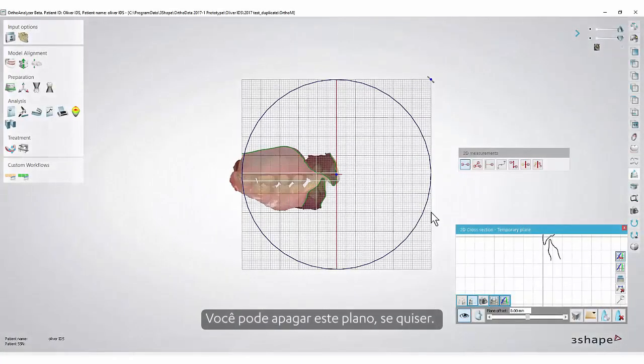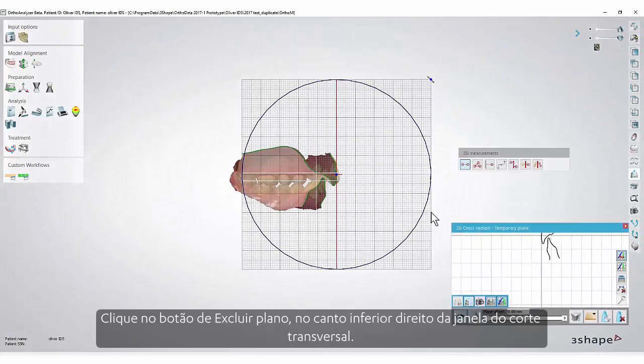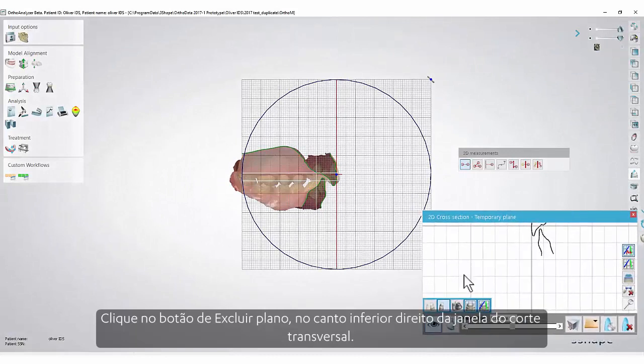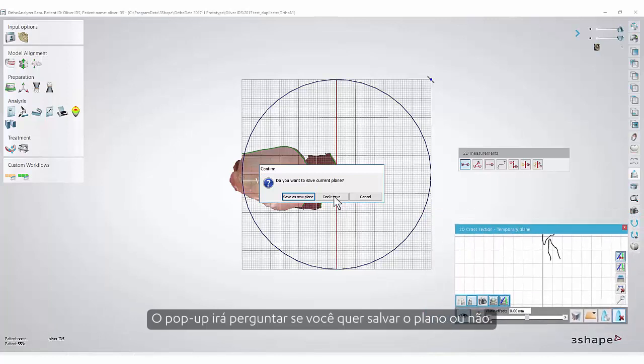Click an icon and set the measurement points on the grid in the usual manner. You can delete this plane if you wish — click the Delete Plane button in the lower right corner of the cross-section window. The pop-up will ask if you want to save the plane or not.